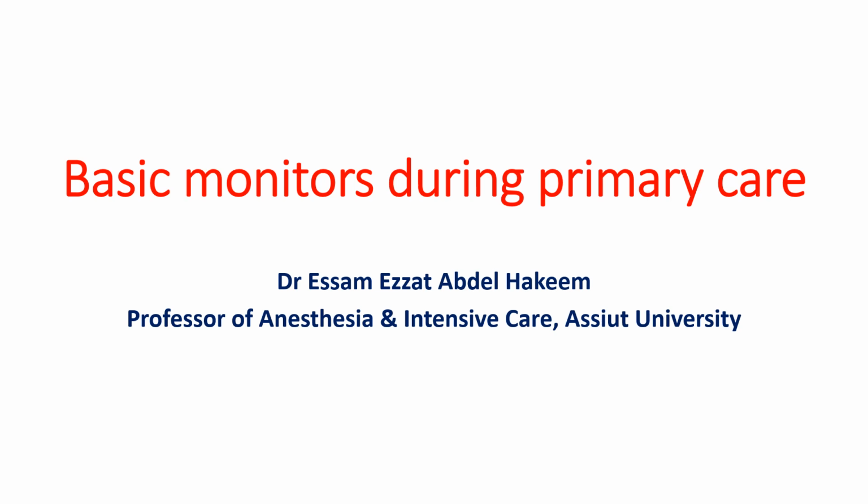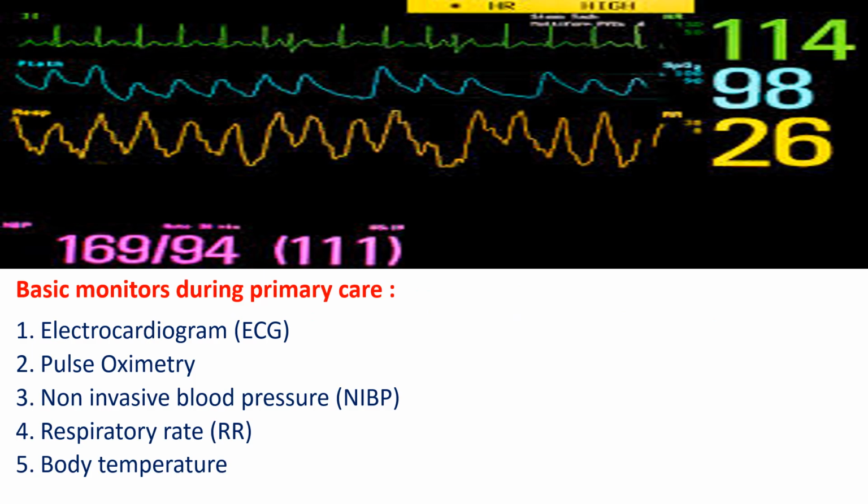My talk today is about basic monitoring during primary care. The most important basic monitors during primary care include electrocardiogram, pulse oximetry, non-invasive blood pressure, respiratory monitoring, and body temperature.